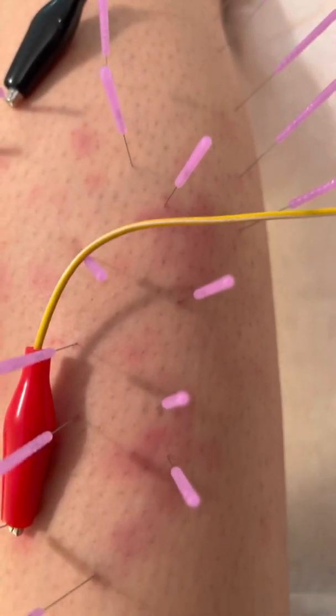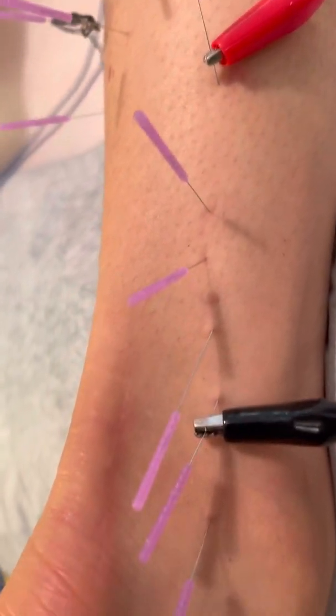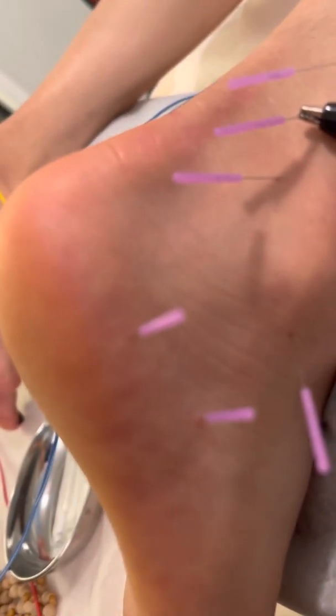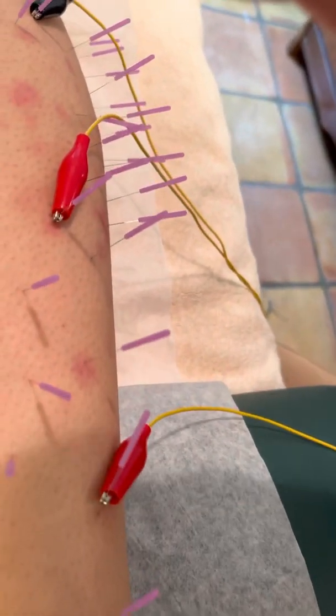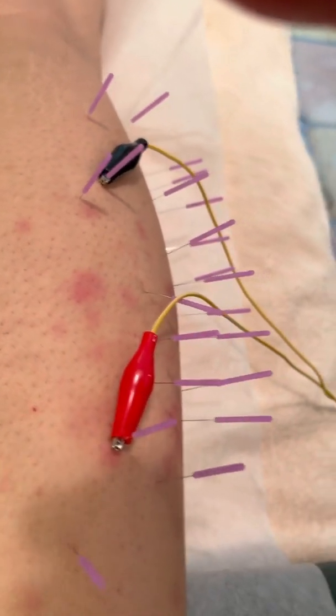So here I've needled along the peroneus brevis, and then down here we've needled more of the peroneus brevis and into the plantar fascia. So here I'll give the camera a second to adjust. Here I'm needling underneath the bone, between the bone and the plantar fascia. And I got really strong releases on those points and on these points as well, where I'm releasing the plantar fascia. And so that's the electrical stim, and you can adjust this electrical stim to make it stronger or weaker.